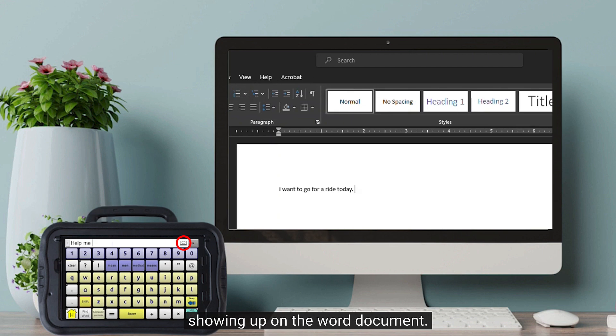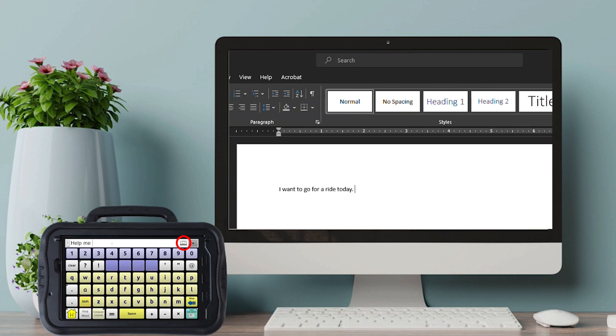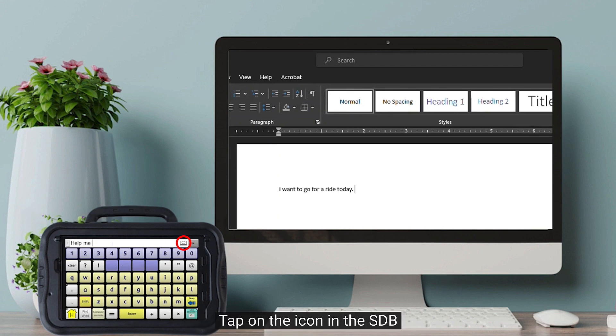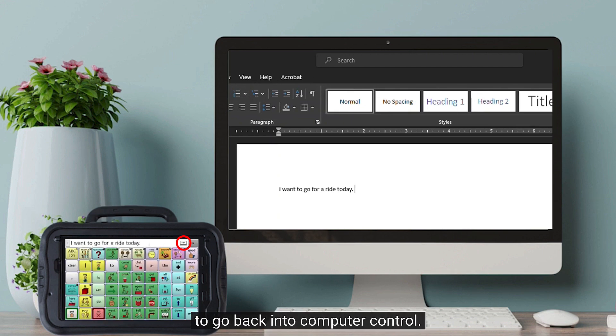For example, say "Help me." Tap on the icon in the SDB to go back into Computer Control and continue typing your message.